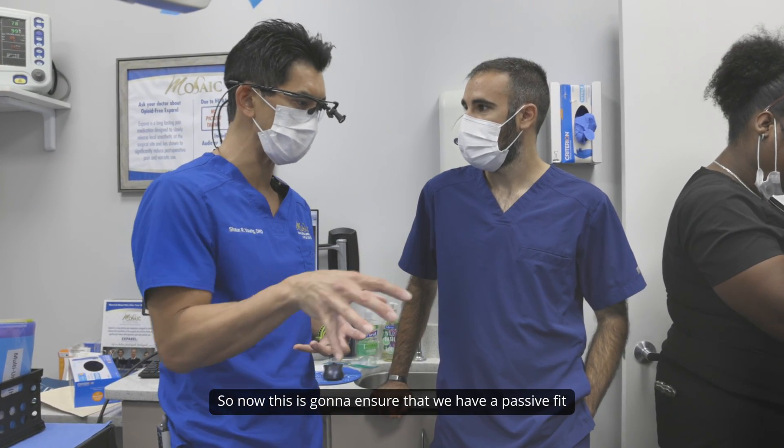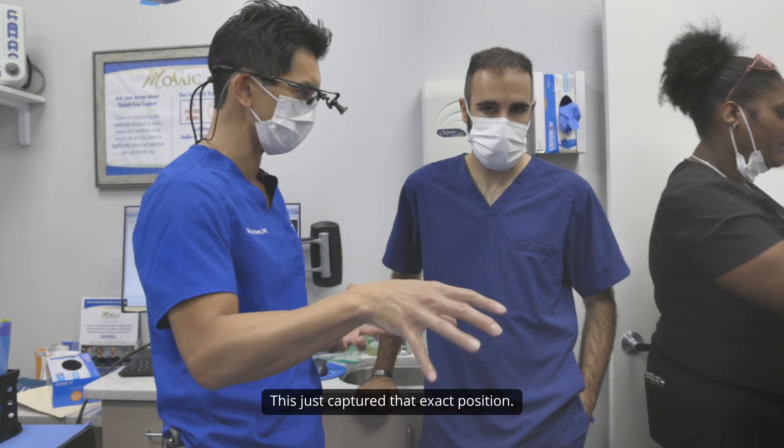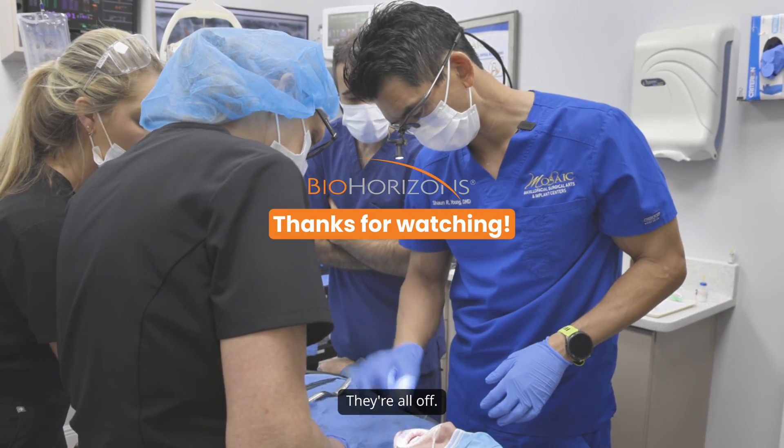So now this is going to ensure that we have a passive fit when we put the temporary in. This just captured that exact position. Now I'm just popping these off — done. 20 seconds and they're all off.